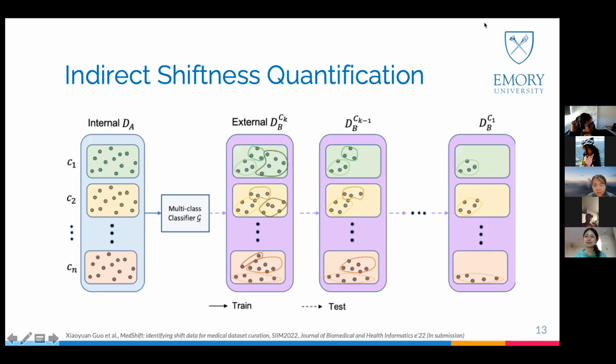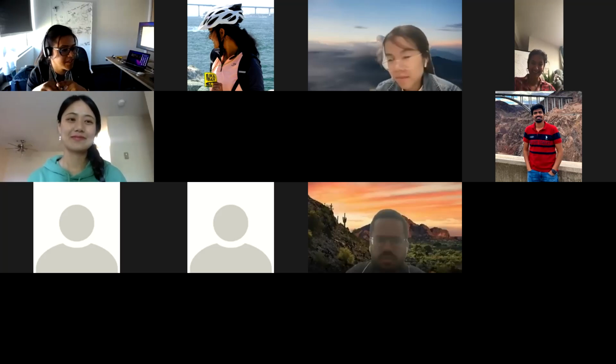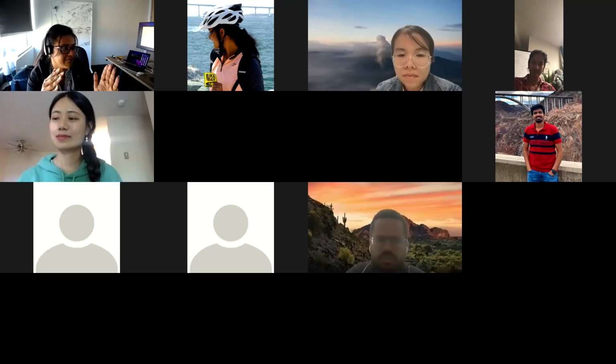I don't know, Nandita, have you played with CheXpert or MURA dataset yet? Yes, I've been starting to think about them. It's probably not really curated data. Oh, I see. Yeah. So the first problem is that there are a lot of inverted images, which are still easy to detect. She already handled that. But there is also the view problem. For example, in chest X-ray, you can see the frontal view and the side view, and everything is mixed together, of course.